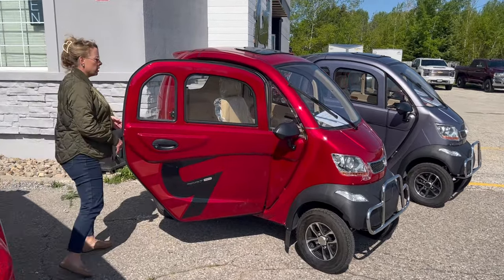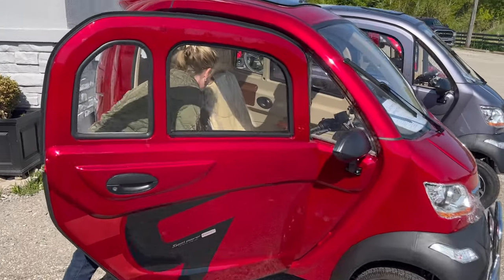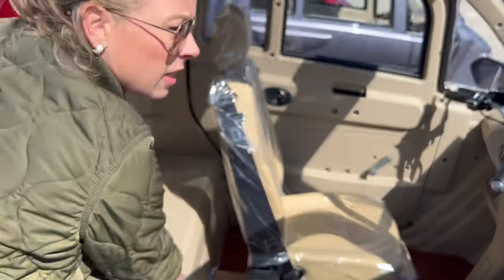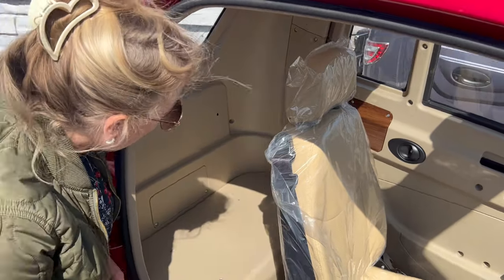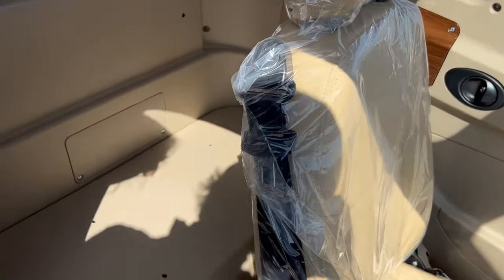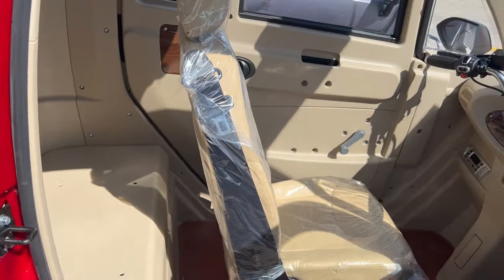Doors open on both sides. This area here is obviously where you can carry a whole bunch of stuff — your dog, maybe. You could put somebody else in there, but that's not really the law, just to let you know.